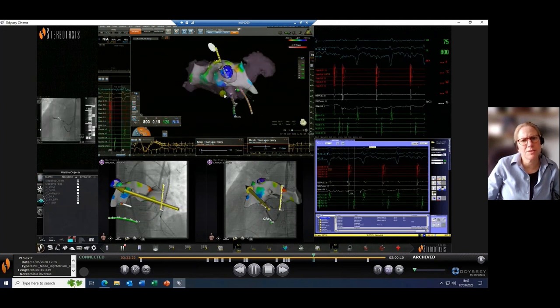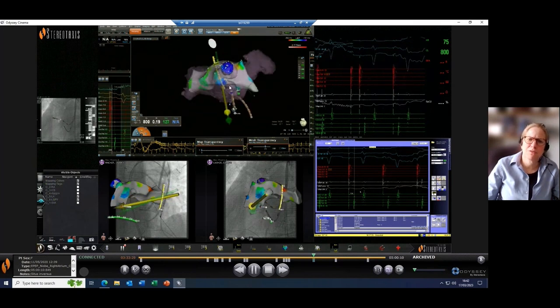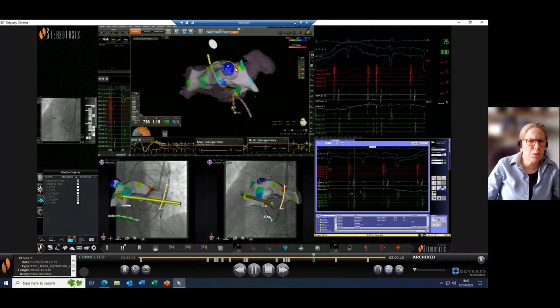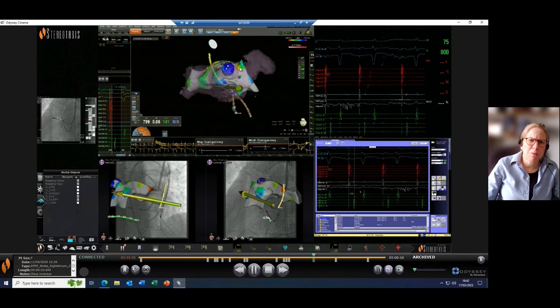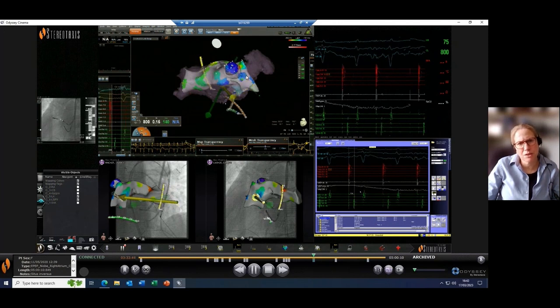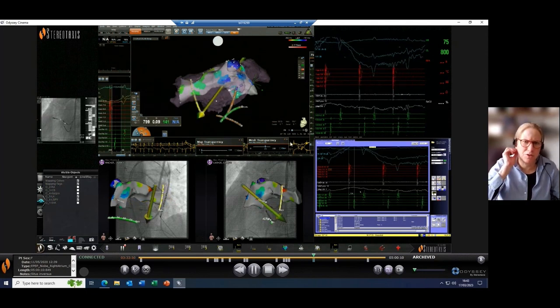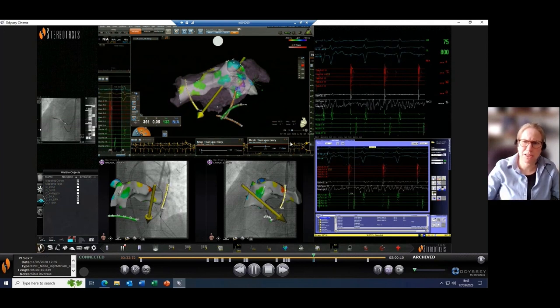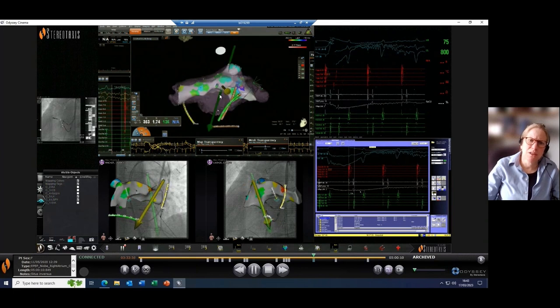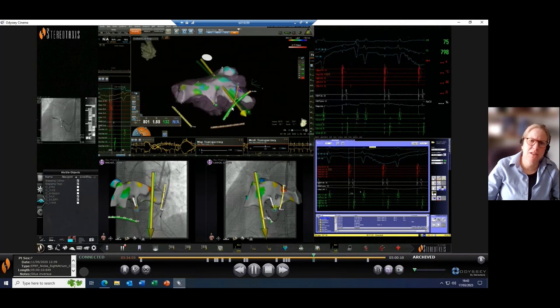She has two separate veins for the septal upper and septal lower, and then two separate veins for the lateral upper and lateral lower. Normal left atrial appendage, quite a wide ridge here. Of course, remember she has a persistent SVC or bilateral SVC, so there is a big vein outside here. And that, of course, makes the ridge very, very thick, and it's quite hard to stay stable. You can see it's easy to move the catheter around. Magnetic navigation is beautiful because it has a soft catheter. The catheter aligns to the direction of the magnetic field. You can see that nicely.